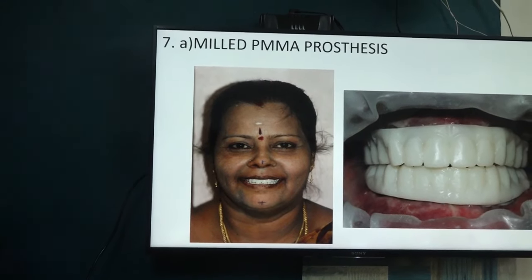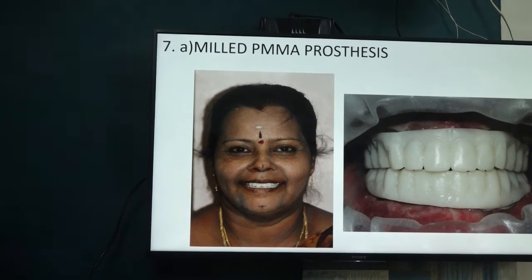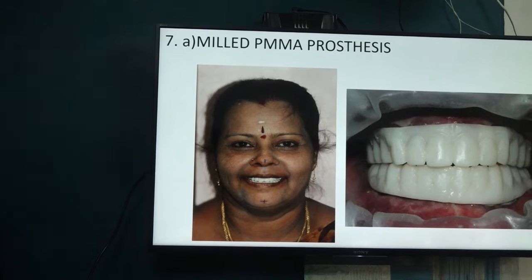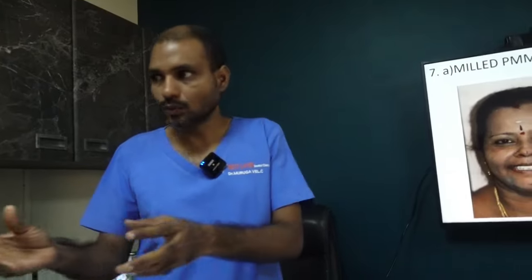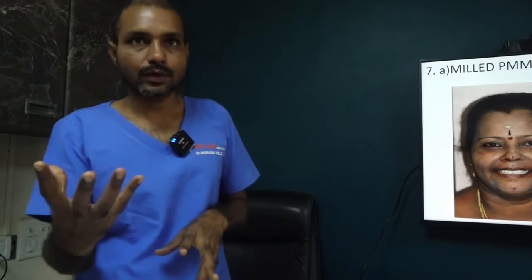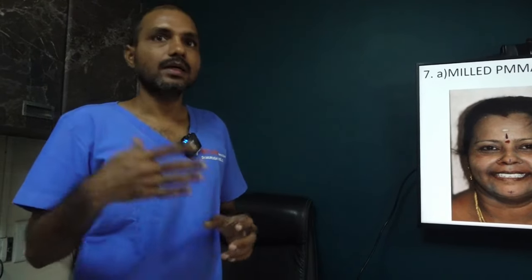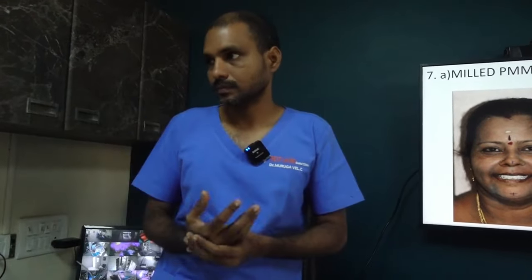Subtractive is not good for the environment because wastage is more and you are throwing all the dust into the environment. With additive, you are using only the material which is needed. When you mill from a blank, there will be a lot of wastage. And milling is time consuming.